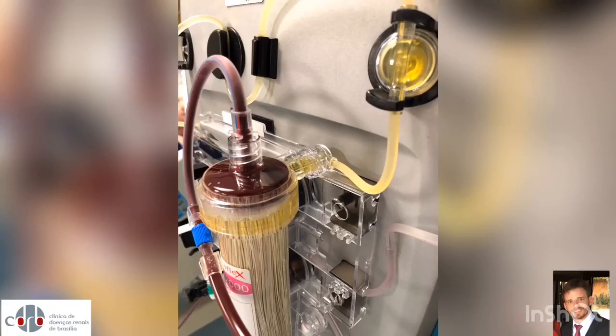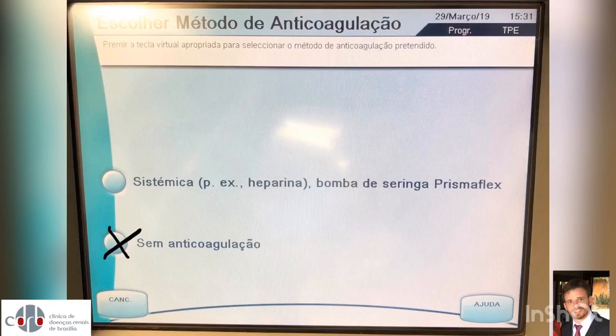Therapeutic plasma exchange tutorial. Select your anticoagulation strategy.